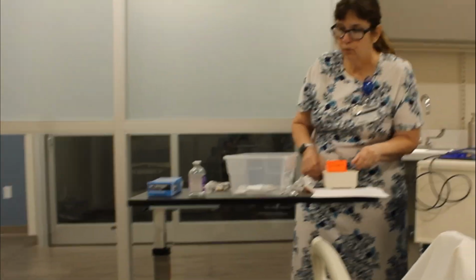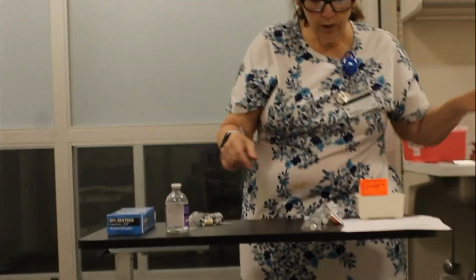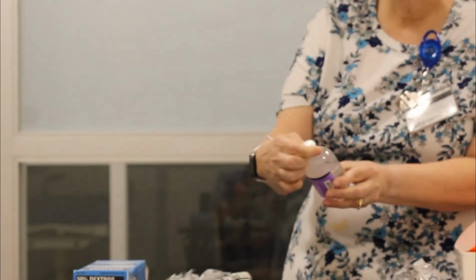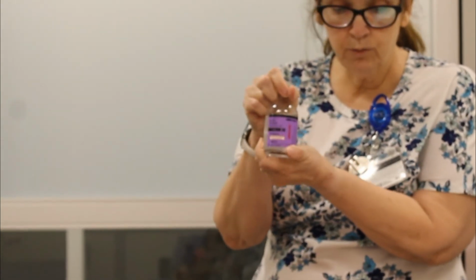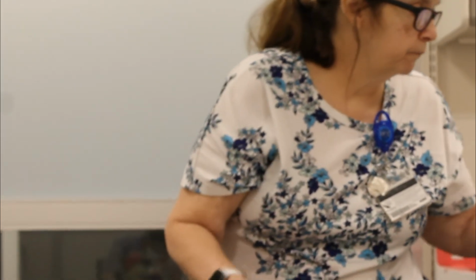All right, so we're going to get the medications together that we're going to give. So I want to show you a few things. One of the medications is calcium gluconate. So I've got your calcium gluconate, and the doctor has ordered 10 mLs of 10%. So it's 10 mL, so I want to make sure that I get a 10 mL syringe, and in this case, because it's a big vial, I want to use a blunt tip needle.